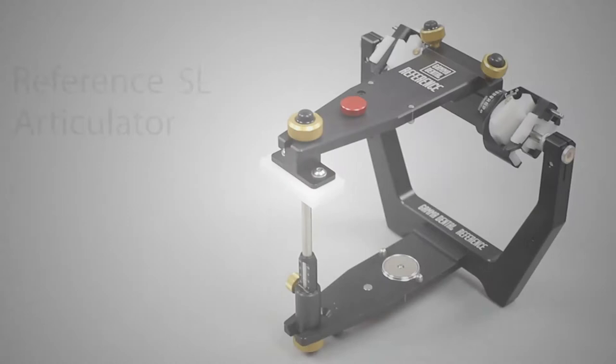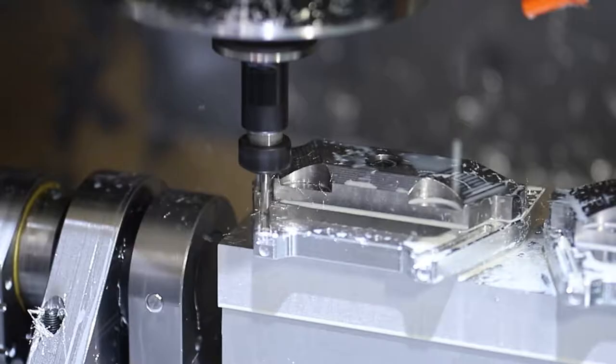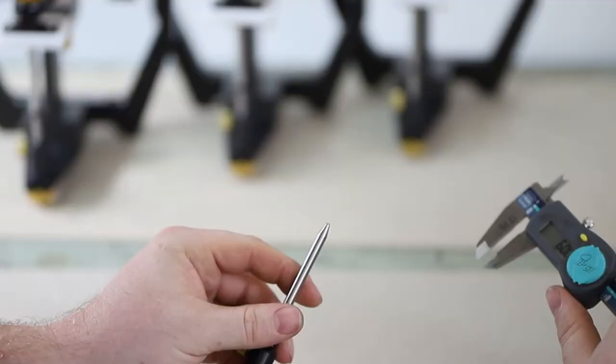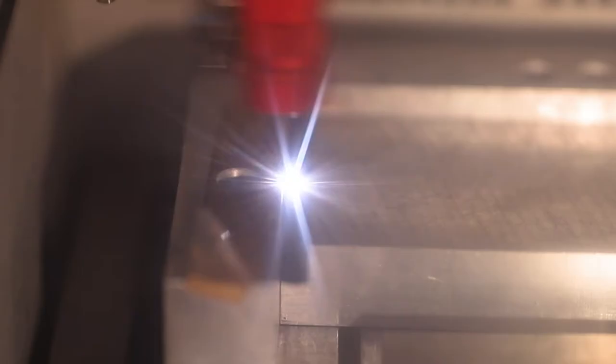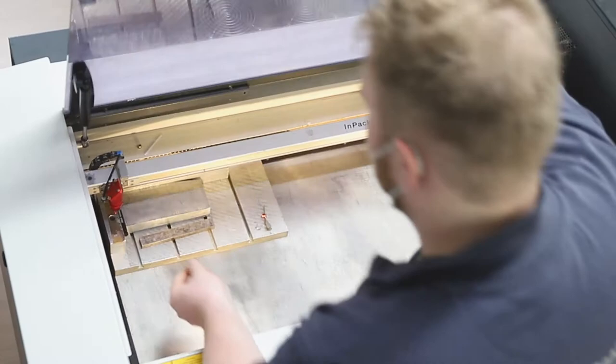Hello and welcome to this Gamma tutorial. Today we will introduce our Reference SL articulator. The Gamma Reference SL is a signature articulator produced for dental professionals under the highest manufacturing skills and quality criteria in our factory in Austria. The device was designed under the instructions of Professor Rudolf Slavicek.